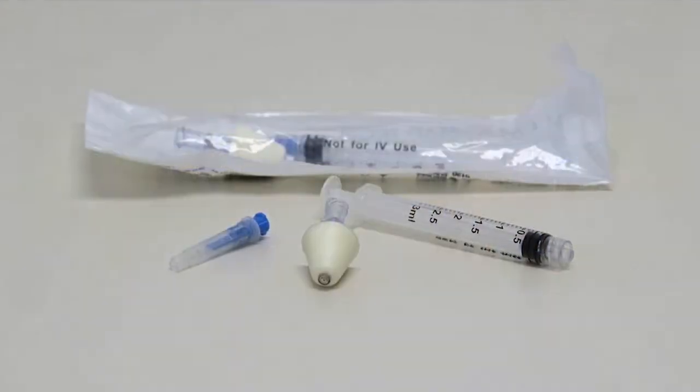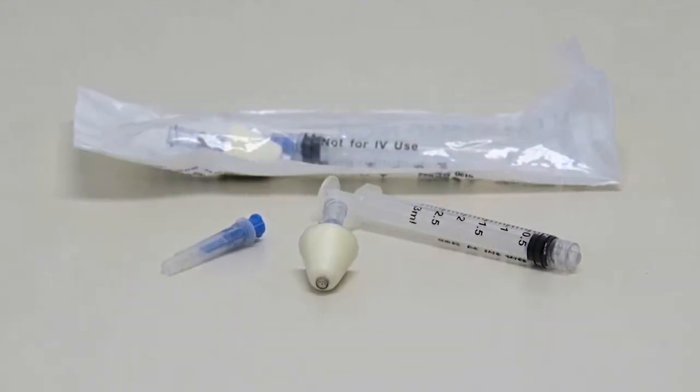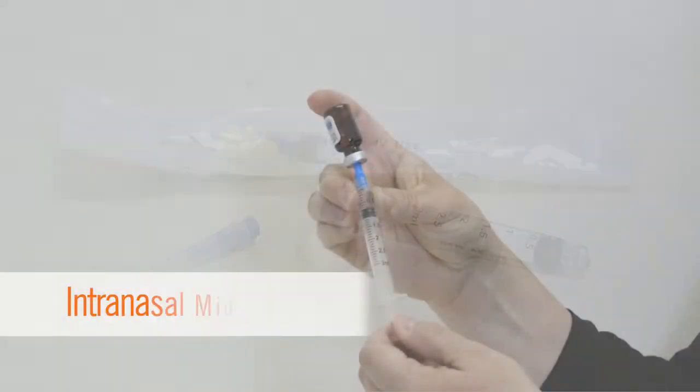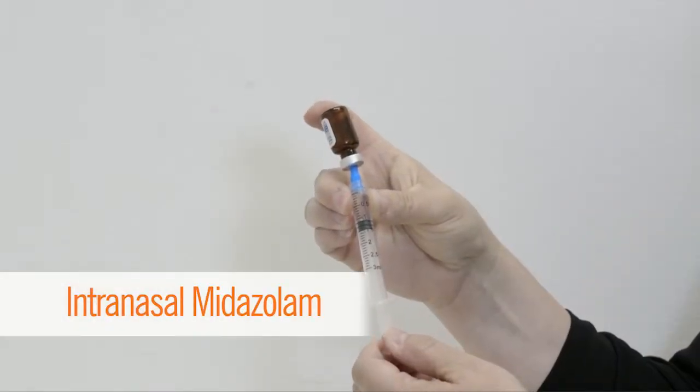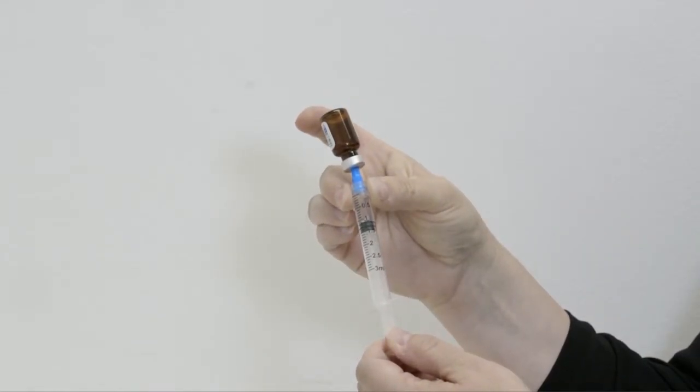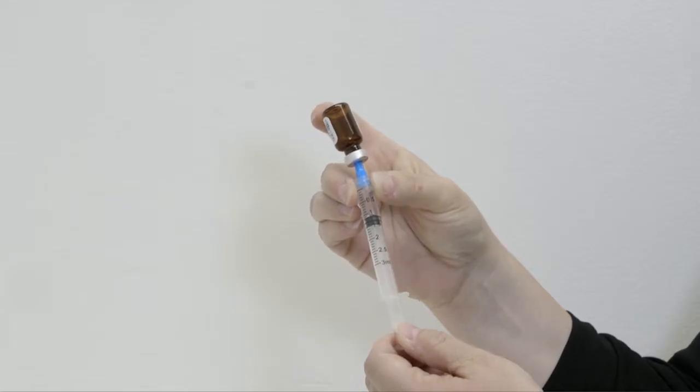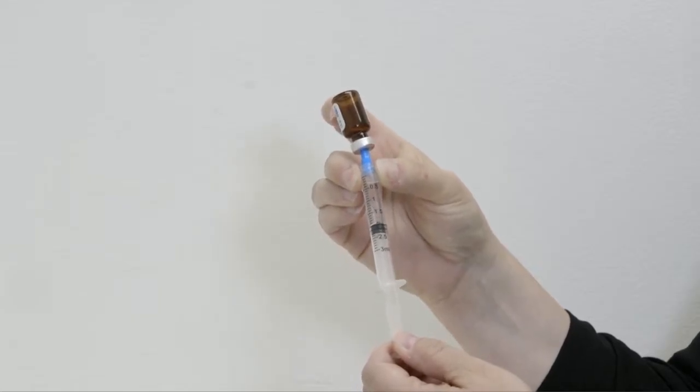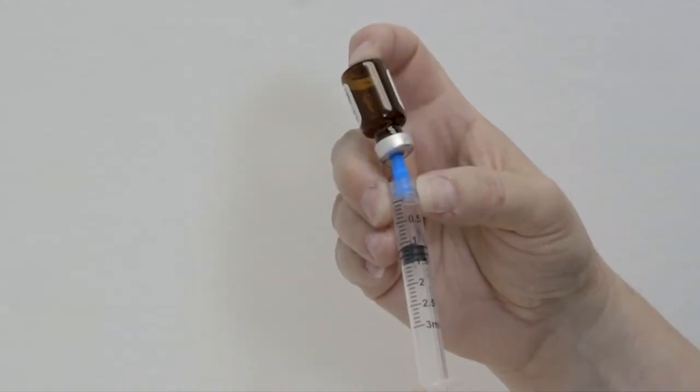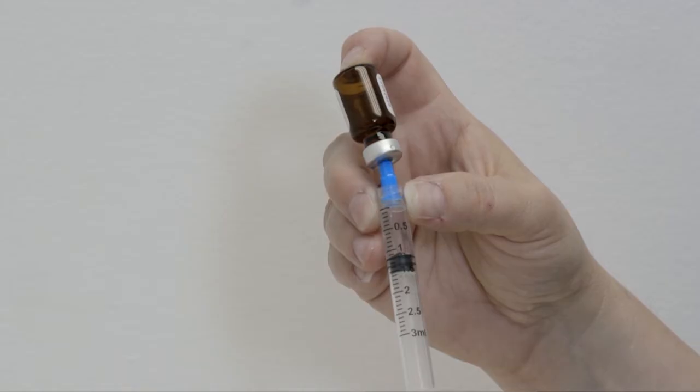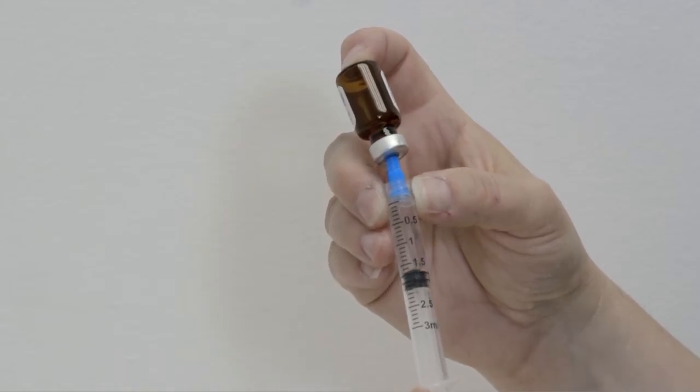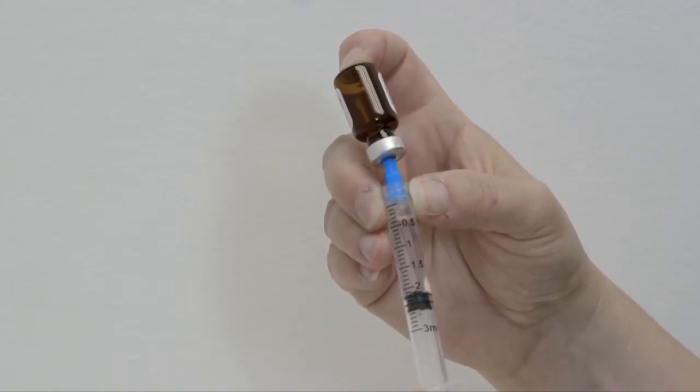You will need the following supplies to administer intranasal midazolam. Intranasal midazolam. This medication will come in a small brown vial. The vial holds two milliliters of medication. Your child's dose will range between one milliliter and two milliliters. Please follow your physician's order for the correct dose of medication.